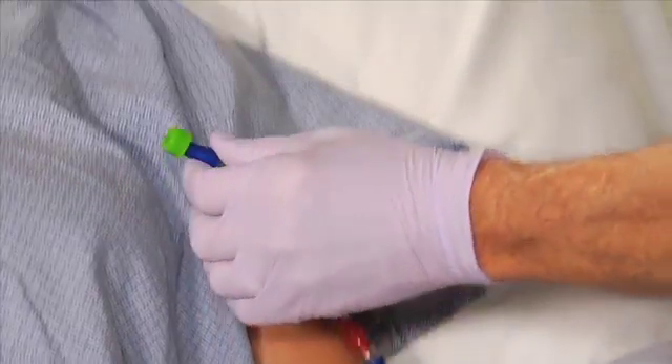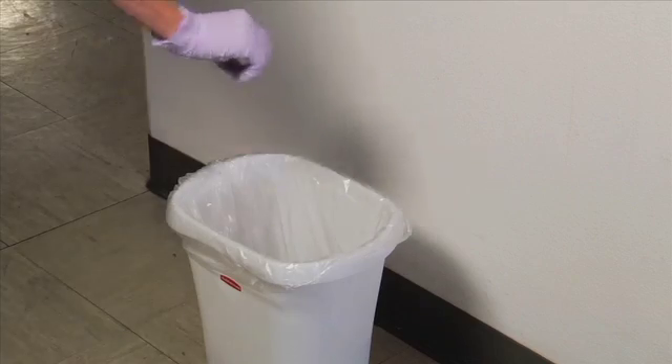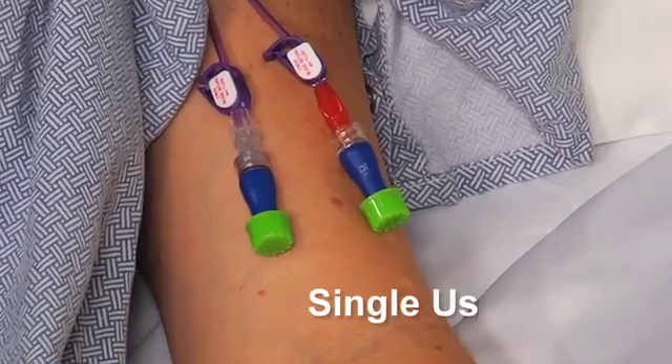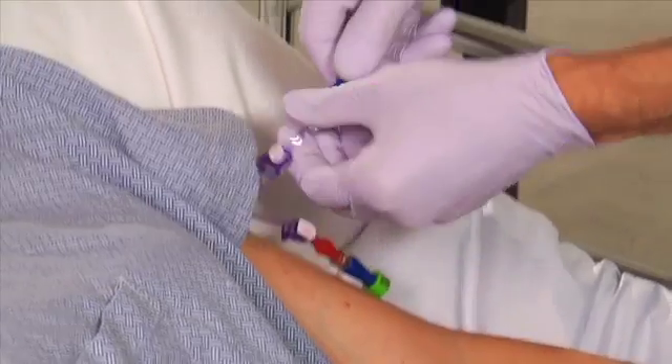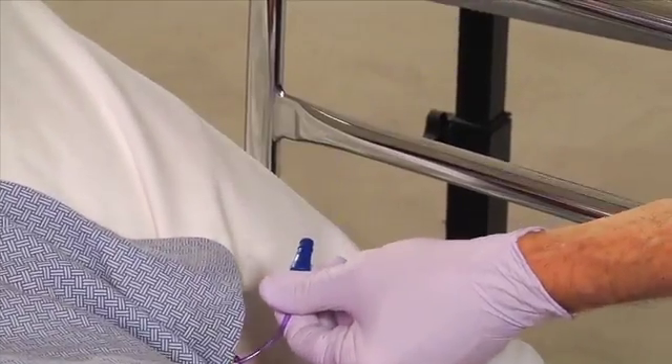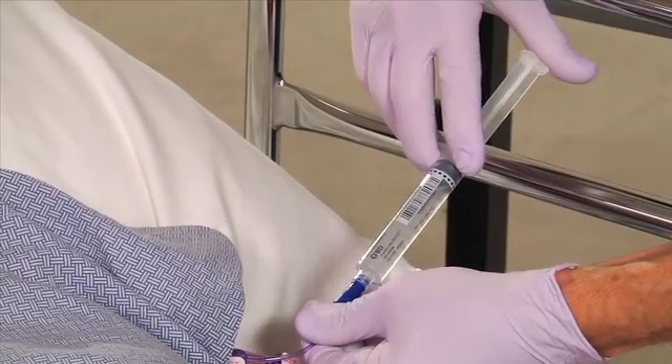When you need to access the needleless connector, remove the CUROS cap and discard it. CUROS caps are single-use only. If the CUROS cap has been in place for at least one minute, simply access the port. It is not necessary to perform a swab procedure.